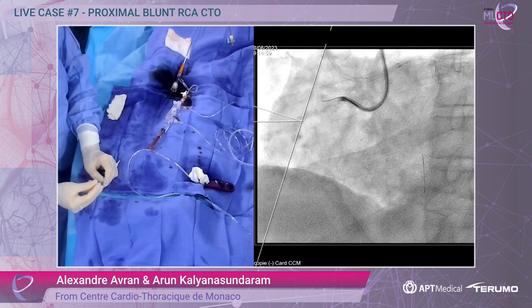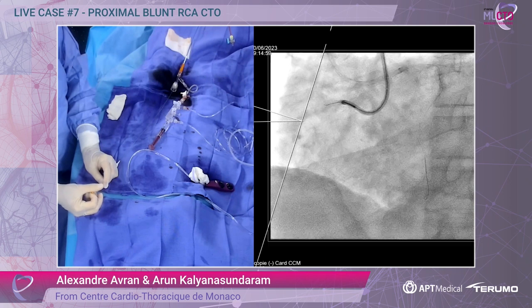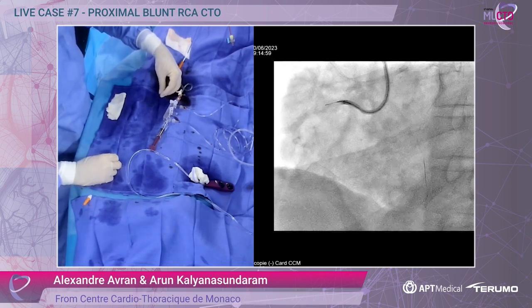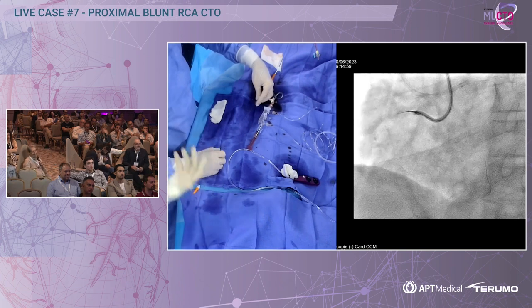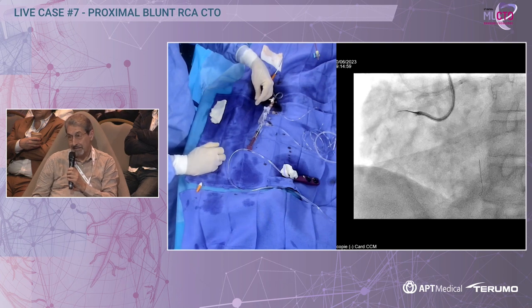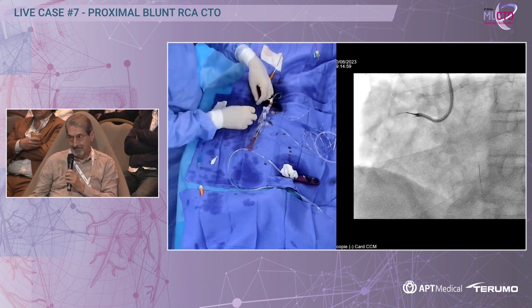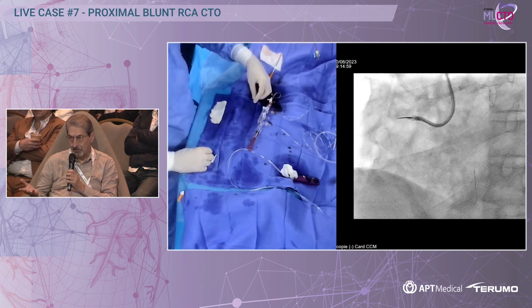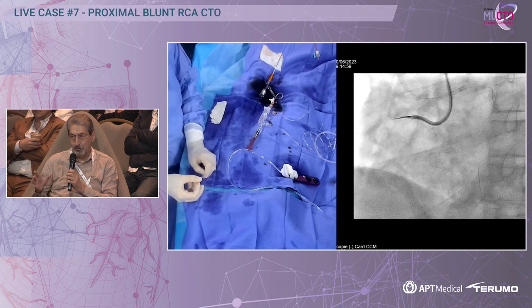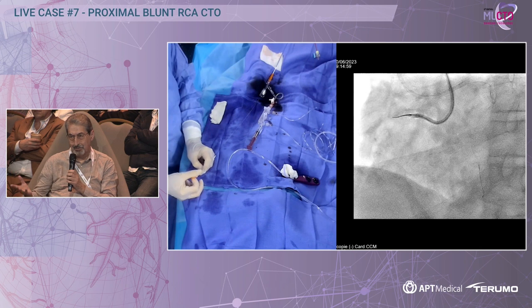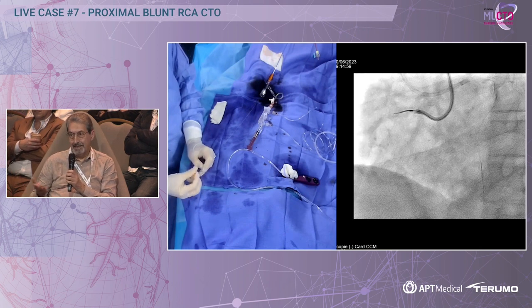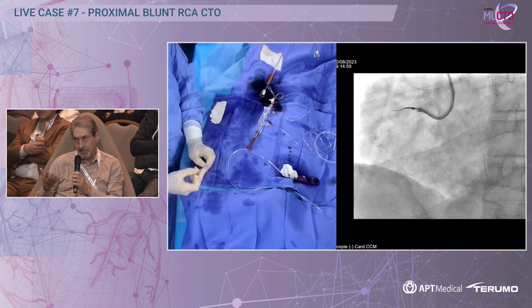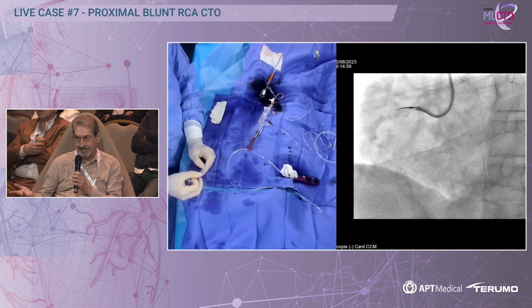Out of curiosity — we decided to go with this wire, but what would be our initial wire of choice? There is a Conqueror. It's always difficult to predict which wire will be successful in such a case. With a 5 mm vessel it's very difficult — you go wrong in the sense that you completely exit the vessel. So you need penetrative force, but avoid extreme penetrating force like a Hornet. You want a steerable wire. Gaia Third is a good choice. And once you've penetrated and the microcatheter is in, the big question is: do you persist with this wire, or take a polymer-jacketed wire like a Gladius?